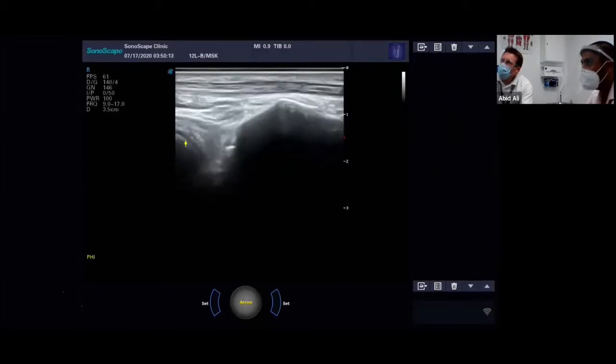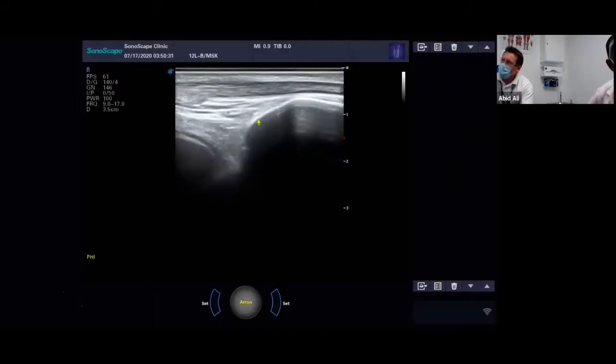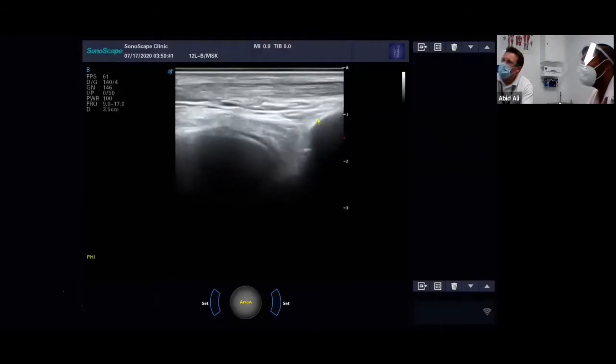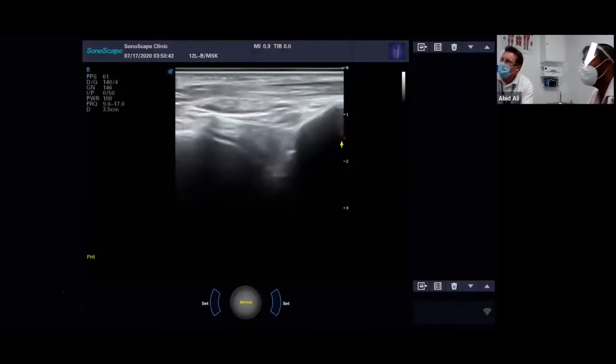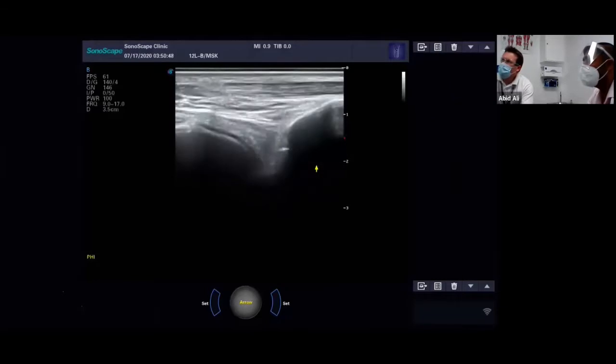Erosions. Not necessarily here, but they'll basically just look like little defects in the bone where it looks like it's been eaten out. Like a mouse has been nibbling at the ends. And then it's always good to put Doppler on that erosion just to make sure that it's not actively eroding away. It's a bit more problematic if there's erosion that's got synovitis within it as well. So yeah, I think that's most of the ankle covered, the anterior ankle at least.